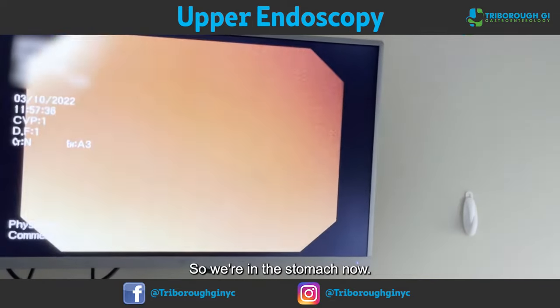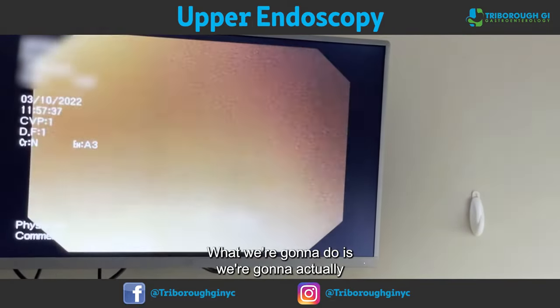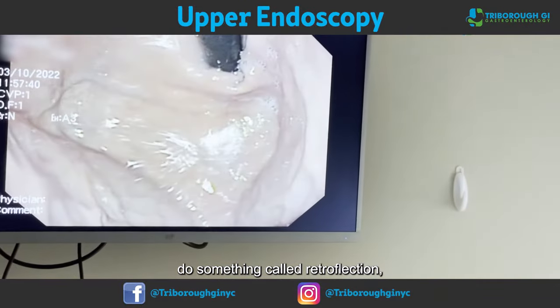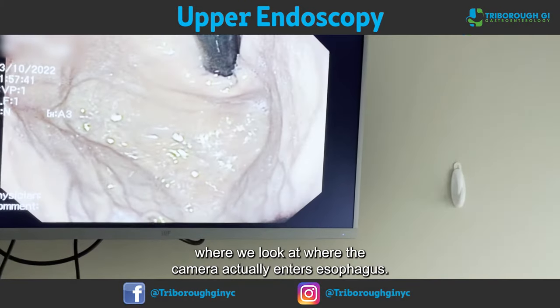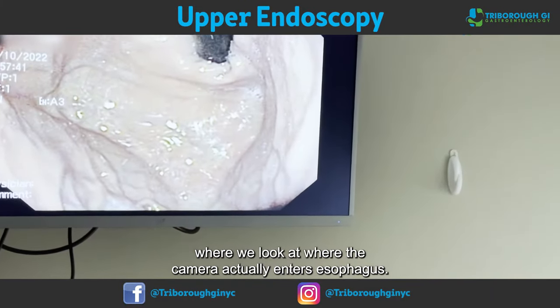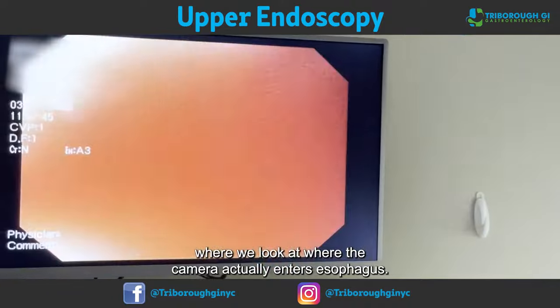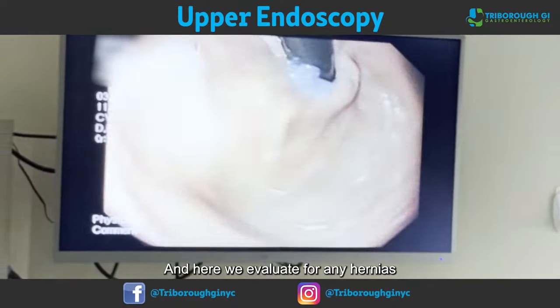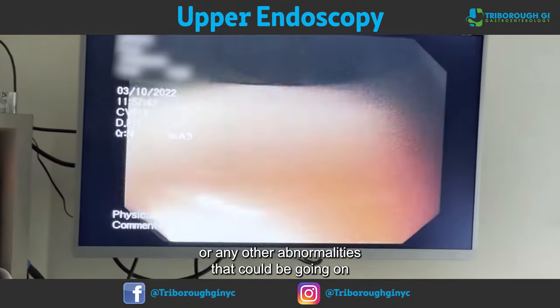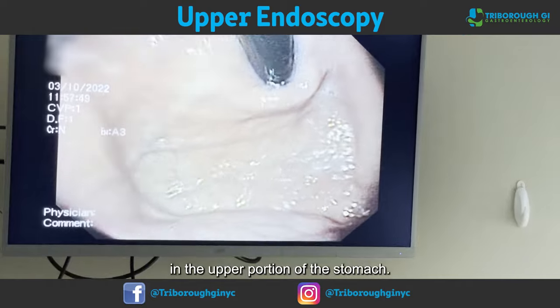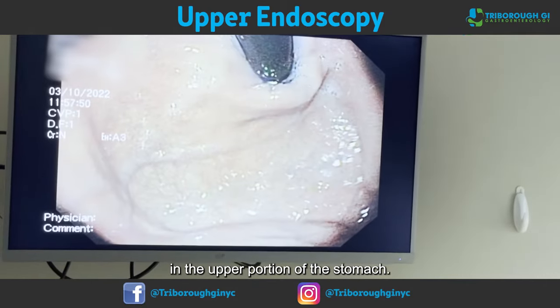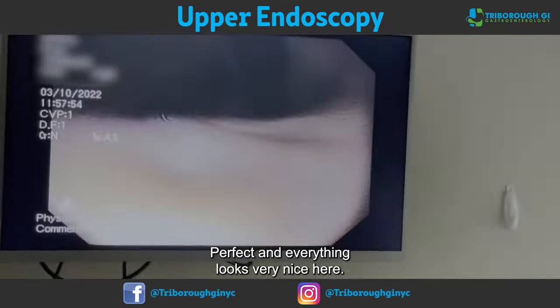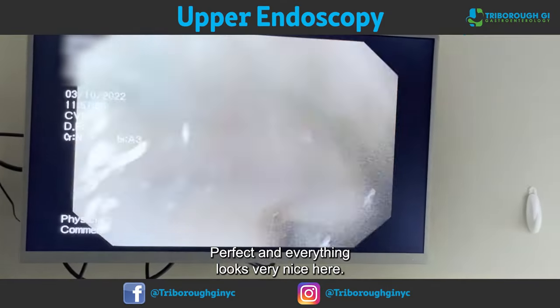So we're in the stomach now. What we're going to do is something called retroflexion, where we look at where the camera actually enters the esophagus. Here we evaluate for any hernias or any other abnormalities in the upper portion of the stomach. Everything looks very nice here.